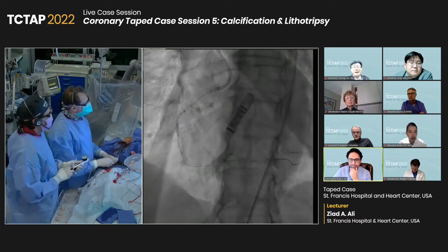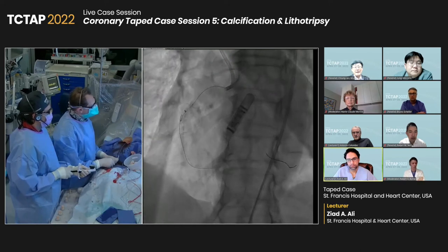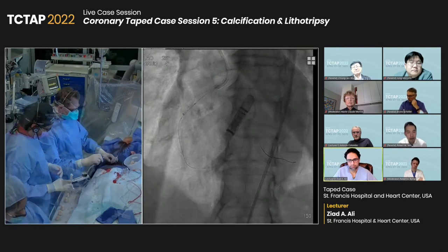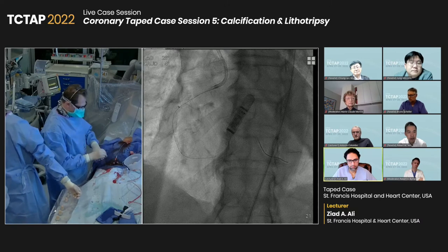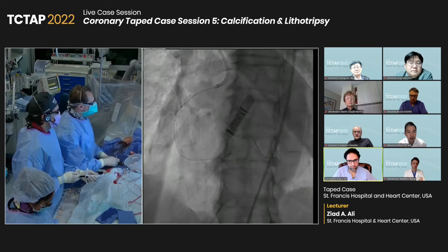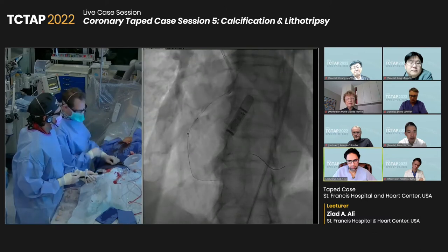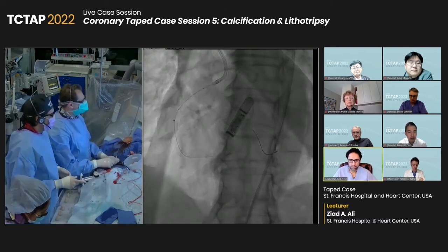Okay. Ready? Yeah. Now. Okay. All right, let's do the 3-0 and see if that works. Well, no, there's some unused balloon. 3-2-5 is used? 3-2-5 is used. Let's use this 3-5. There it goes. I think it goes around. Wow. That's a hell of a corner. Yes, okay. That made all the difference. Good example of what you need to do to get across.